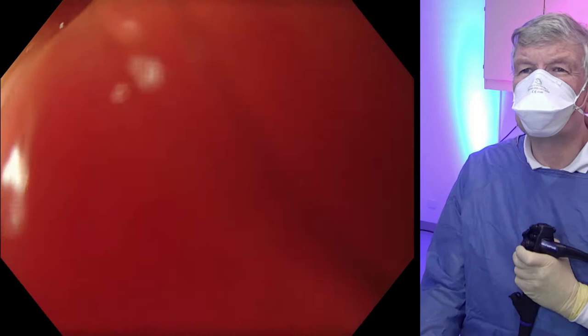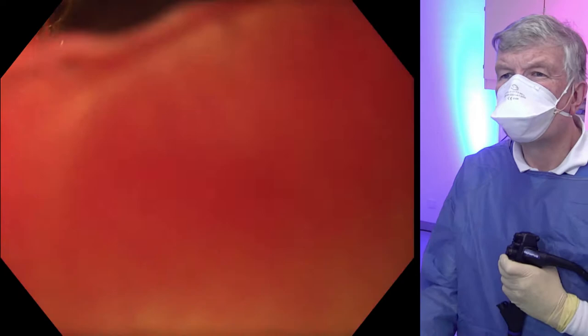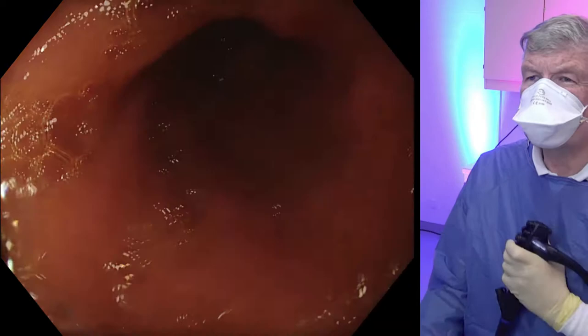This is the direction the endoscope has to take, and also the channel has to take around this curve. The pylorus itself in motility disorders is difficult to assess — it's not always narrow, like with POEM. If you push a little bit you then see the sphincter, which actually looks like in any patient.